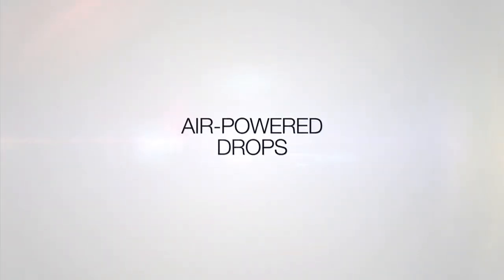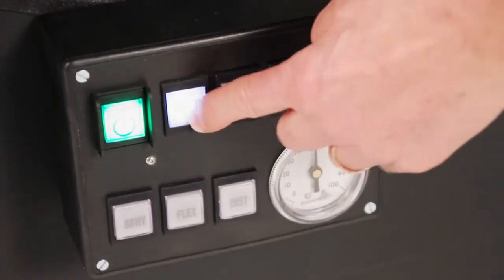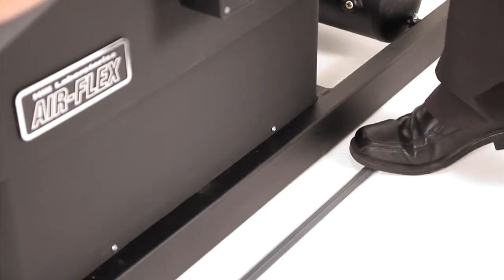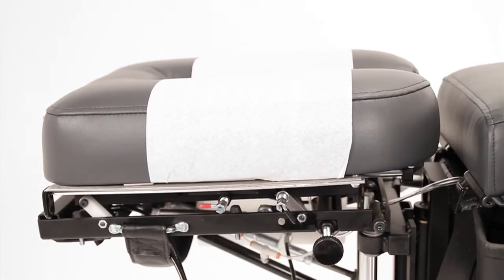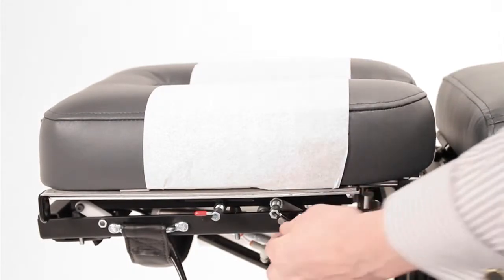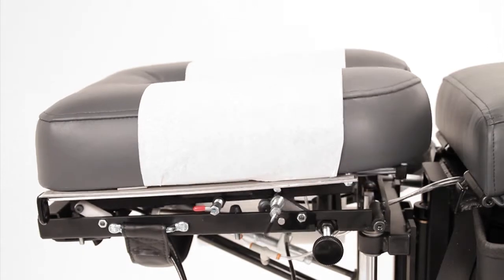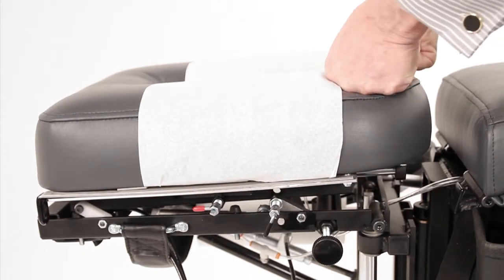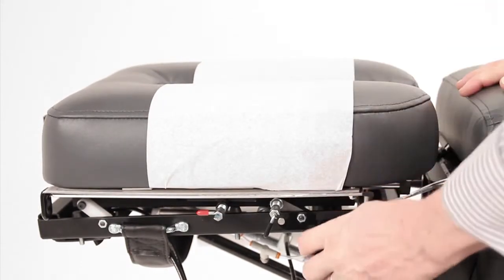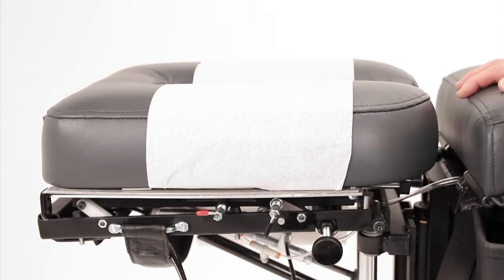Since the AirFlex uses air-powered flexion, adding up to 4 air-powered drops is an option, all controlled by the pressure pedal or foot strip shown here. The cervical air drop contains 2 drops and 1 headpiece. The first is a forward motion drop. Pull and rotate the black pin just below the cushion to convert the forward motion drop to a straight down motion drop. Adjust the tension knob to control the amount of force required to use the drop.